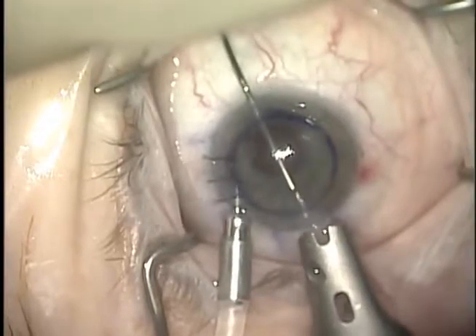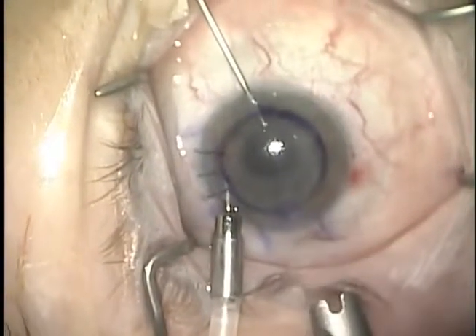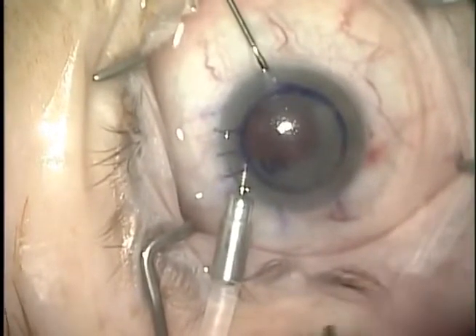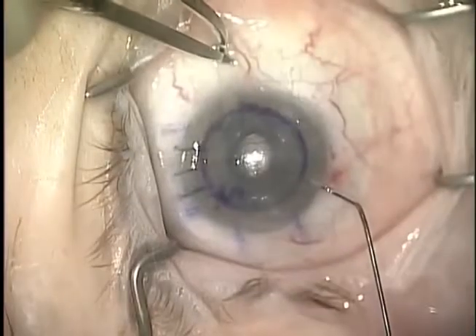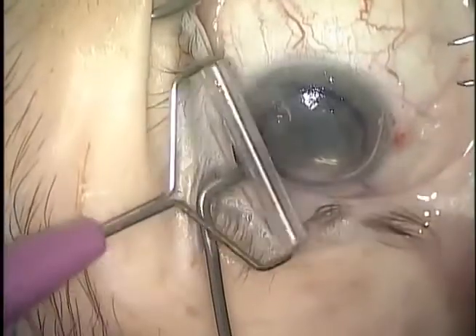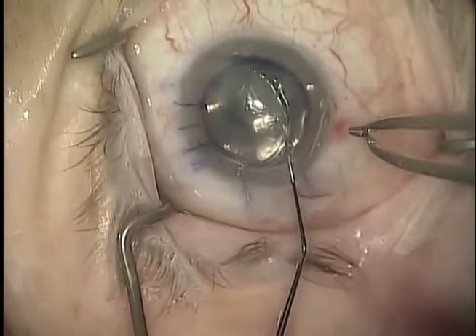The graft is carefully positioned into the anterior chamber. Fluid is removed from the interface to bring the graft in contact with the patient's cornea. Air is injected underneath the graft to secure the attachment to the patient's cornea. A roller is used to help position the graft. Finally, a Szynski hook is used to bring the graft to the final position. The anterior chamber is left air-filled for 10 minutes.